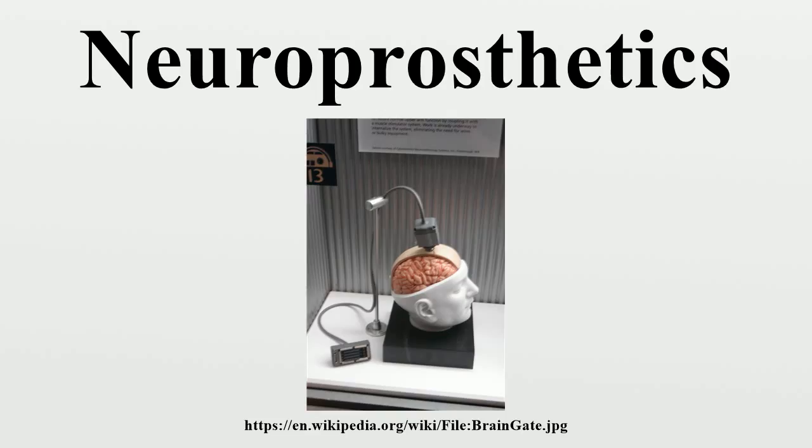Cochlear implants have also been used to allow acquisition of spoken language development in congenitally deaf children, with remarkable success in early implantations. There have been about 80,000 children implanted worldwide. The concept of combining simultaneous electric-acoustic stimulation for the purposes of better hearing was first described by C. von Ilberg and J. Kiefer, from the Universitätsklinik Frankfurt, Germany, in 1999. That same year the first EAS patient was implanted.